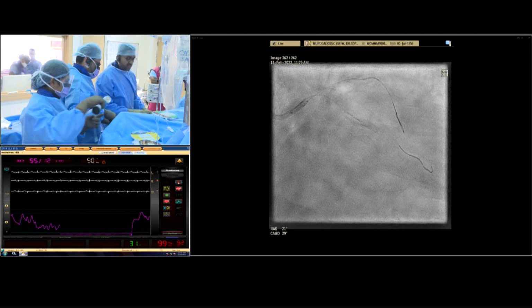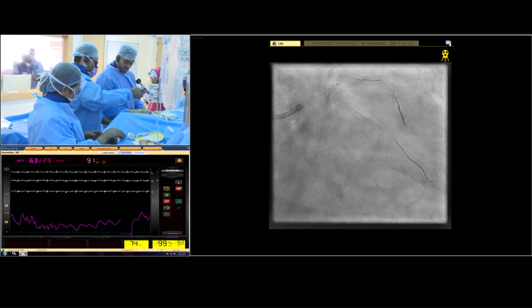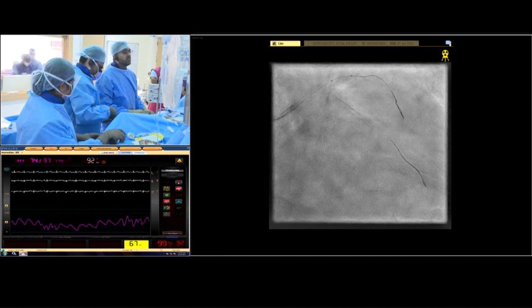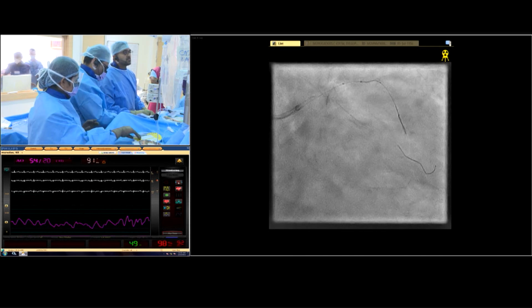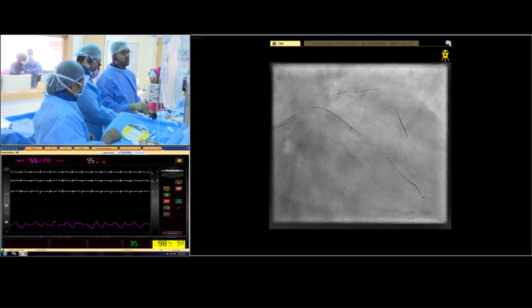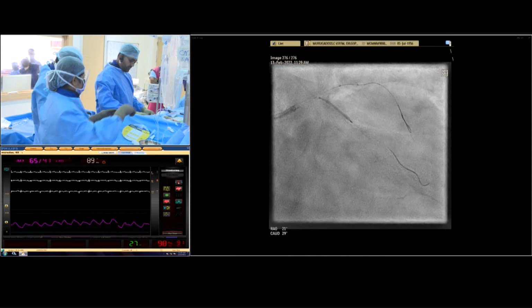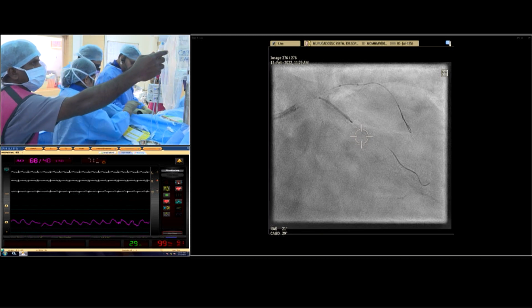So we're getting a stent going in. Again, the circumflex stent is just being introduced as we speak. Be prepared to load the stent. Okay, cone down, super mag, and give me a bifurcation view. Stent boost on.